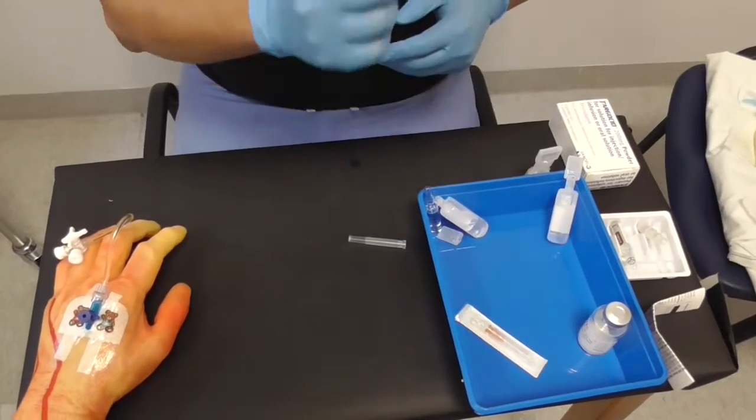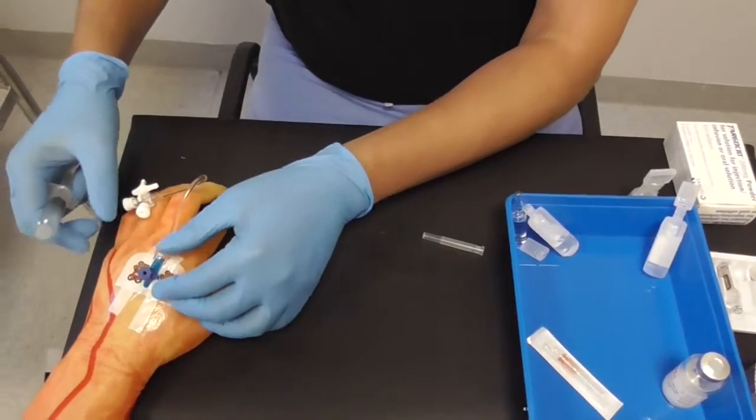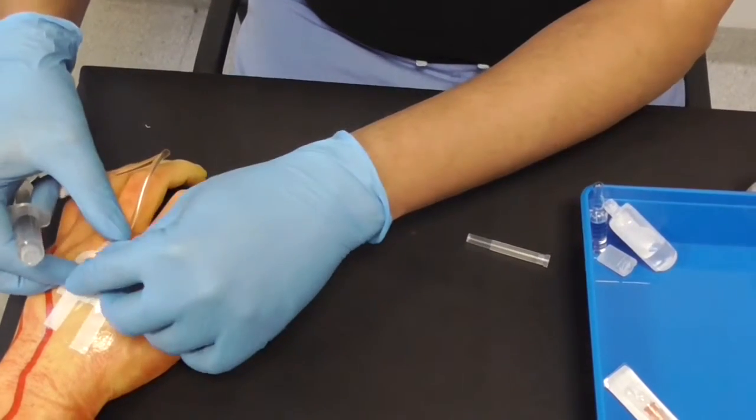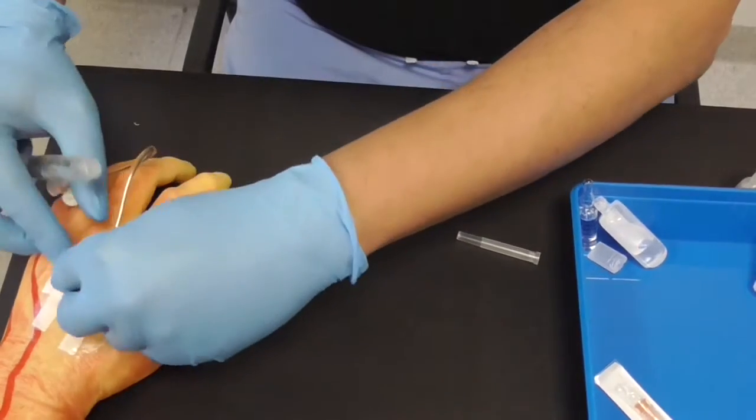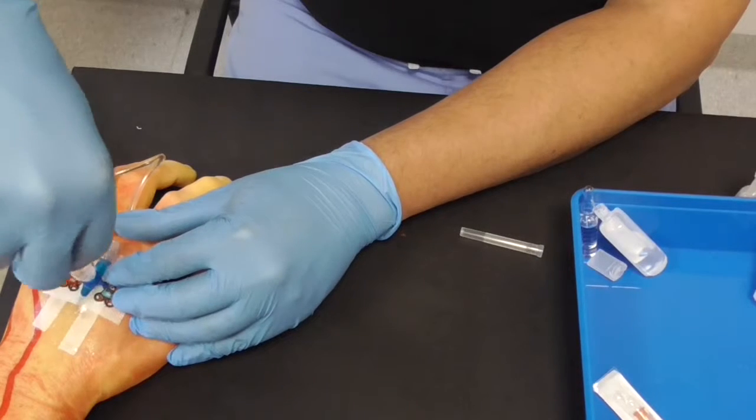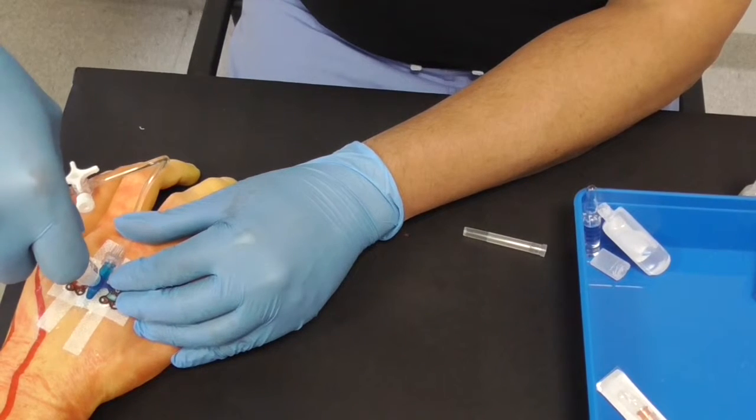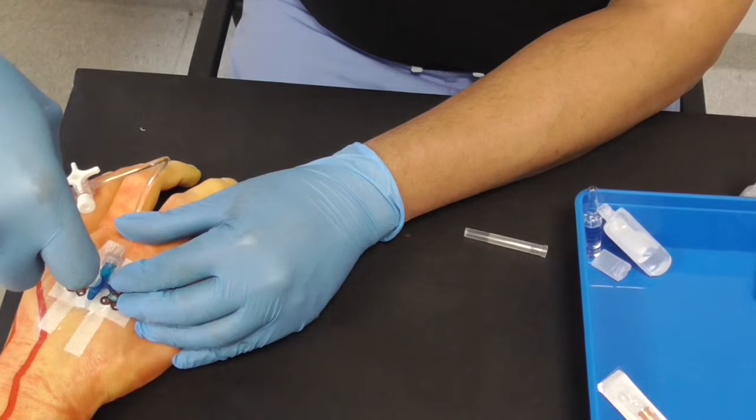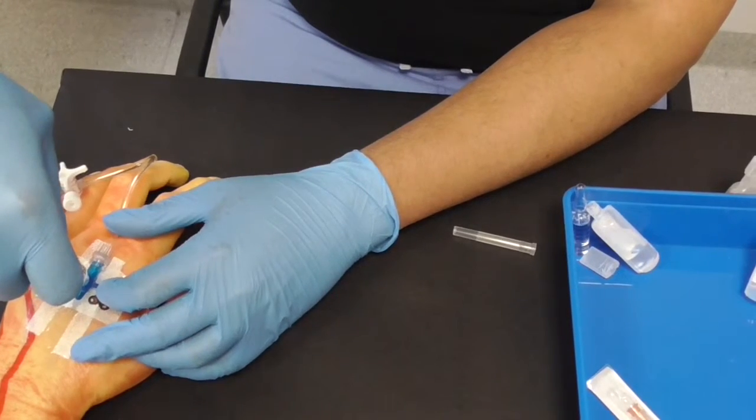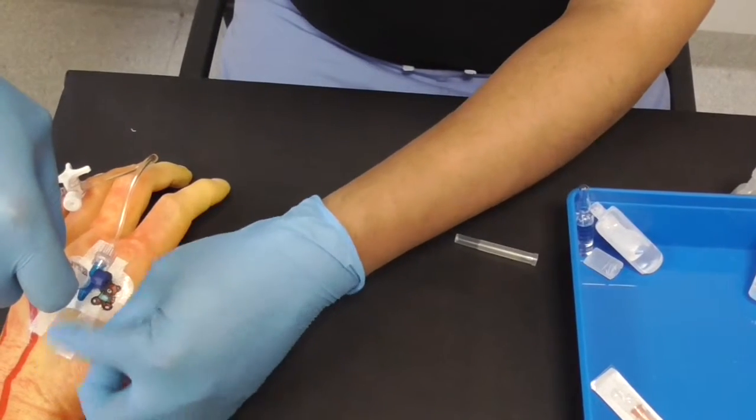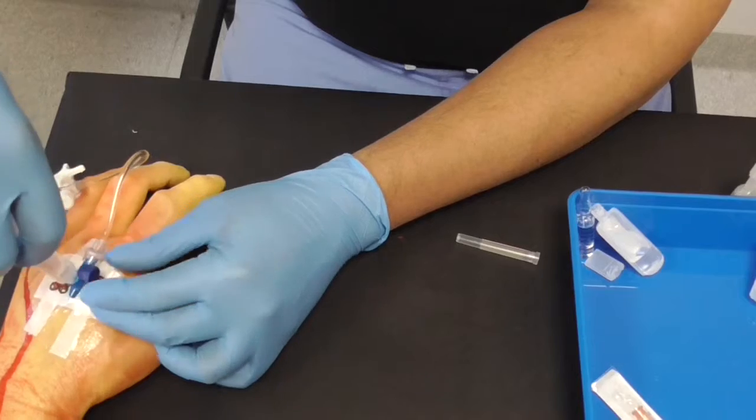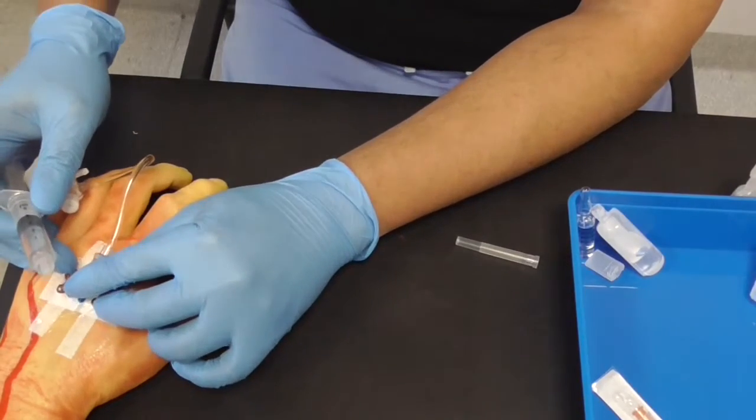And when you're ready to then give your medication, if it's an IV medication on the ward, we have this. This is not a real patient, I'm sure you understand. If you've got the patient here, make sure this is capped off. This is an intravenous cannula. You lift that, you put that in, and you push a little bit to get in the valve and then you just gently administer. Now when that is going, make sure the patient is aware that it's going in. If they complain of pain, you may want to stop. If there's a bit of swelling here, it means the cannula has extravasated or is out of the vein and you may want to stop. Obviously tell the patient if you get any discomfort anywhere that you may need to stop as well.